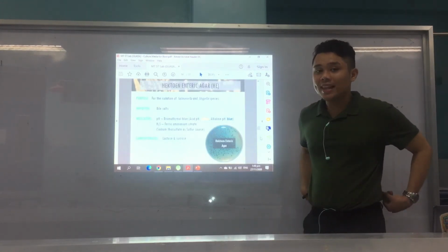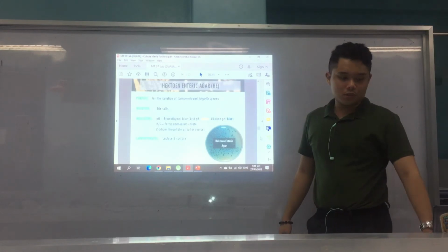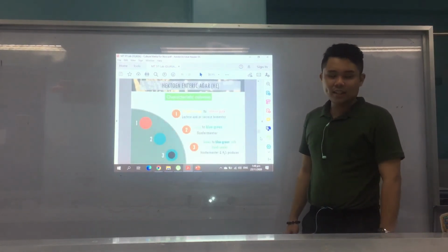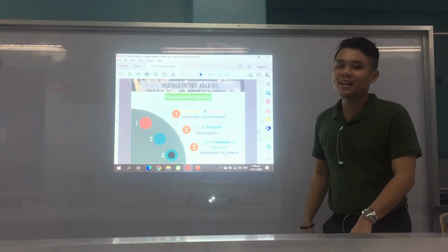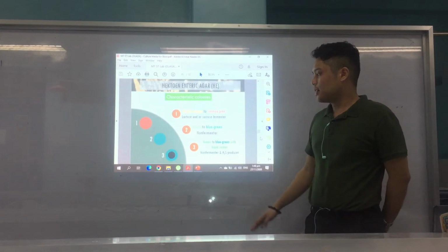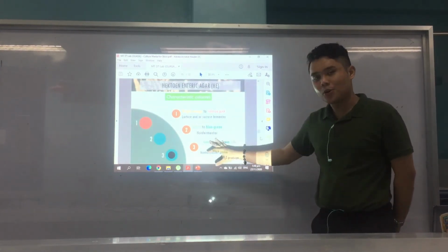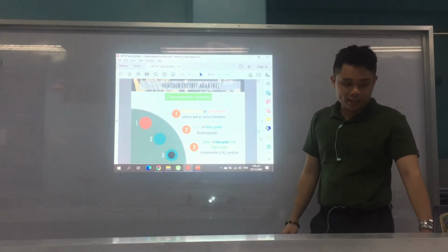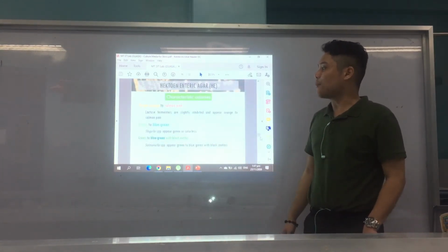And still sodium thiosulfate ang sulfur source. So same with TSI. And the carbohydrates this time kay lactose and sucrose. And your characteristic colonies: bright orange to salmon pink, lactose and or sucrose fermenter. Green to blue-green, non-fermenter. And then green to blue-green, naay black na pod, non-fermenter pero H2S producer.